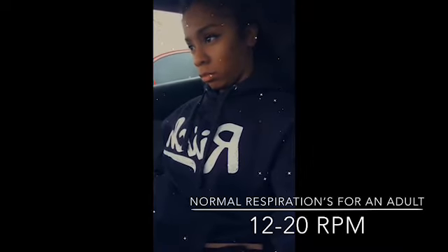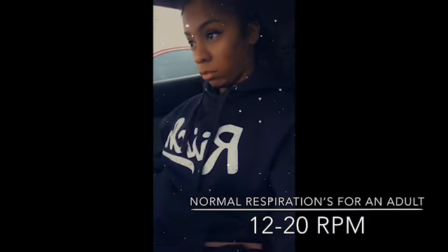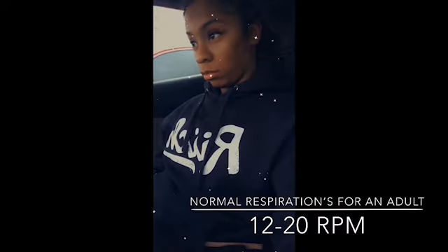Okay, so when dealing with respirations, you want to check it while you're checking the pulse, so that your patient doesn't know that you are taking their respirations. So you want to watch for the rise and the fall, the steadiness. If they're having difficulty breathing, like if they're holding their breath, or you see the muscles working, just watch how they're breathing and record everything that you see.